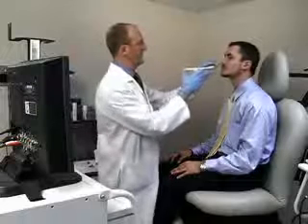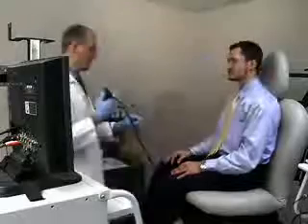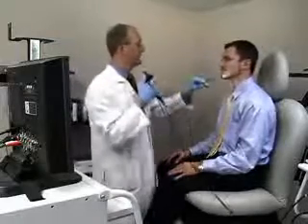Once the nose is adequately prepared, the procedure may begin. The patient is comfortably seated upright, again facing the examiner with his or her face at eye level.